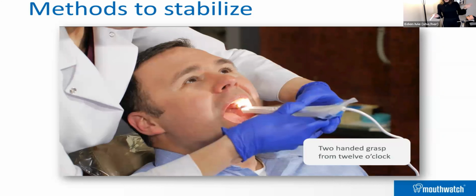Okay, this is another technique that I learned from a dental hygiene instructor, and it's a two-handed grasp, but you are behind your patient. You're at 12 o'clock. So you come in, your patient is sitting up, you're behind your patient, you come in two-handed. Let's see if we can get a better view here. And you come around and you're very stable and you move very quickly through the mouth. You just snap your images, you flip your camera over, and you come right back through to do the mandibular. This is a very, very nice, smooth, quick way to take a series of images.